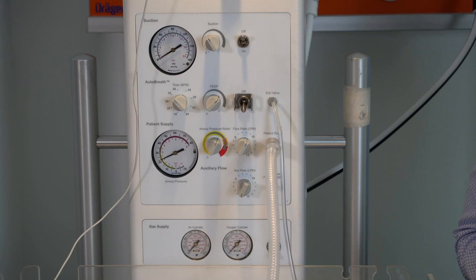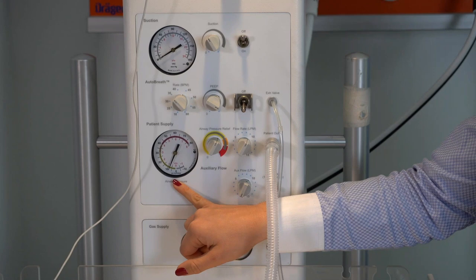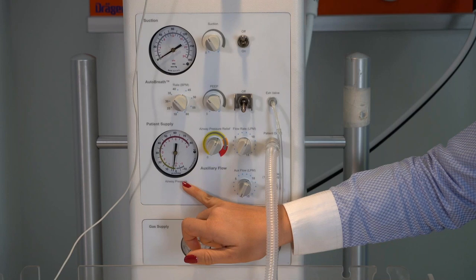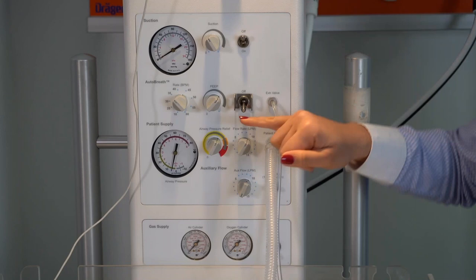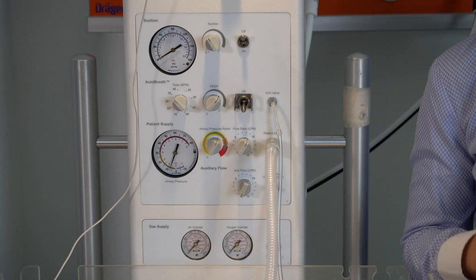I can also now manually control the PEEP setting. So if we pay attention to the pressure gauge, now our PEEP is higher. If I reduce it, now our PEEP is much lower. Here on the PEEP setting, we also have a little mark on top that indicates the recommended settings. But of course, depending on your patient condition, depending on the patient outcome, you can change the settings.